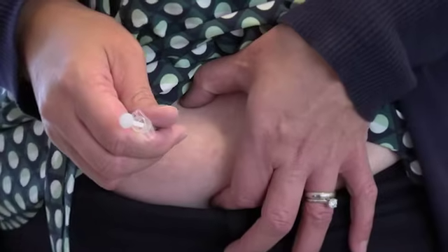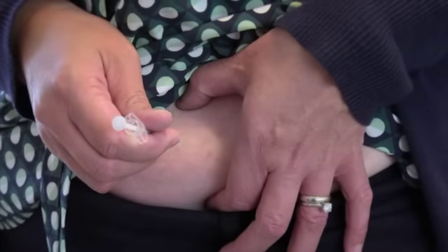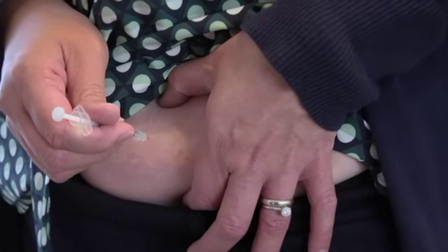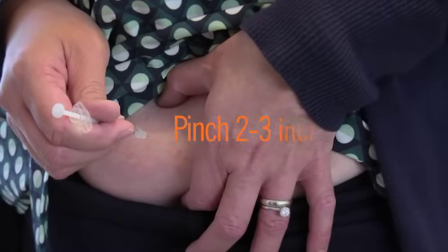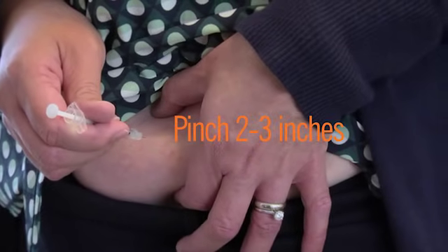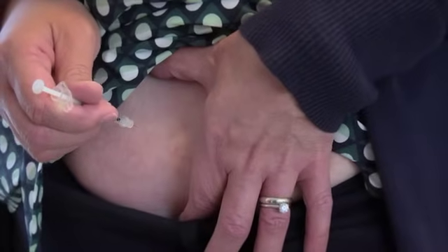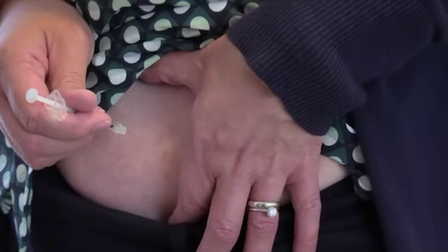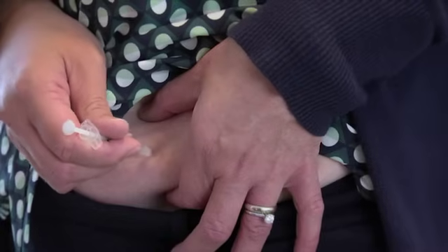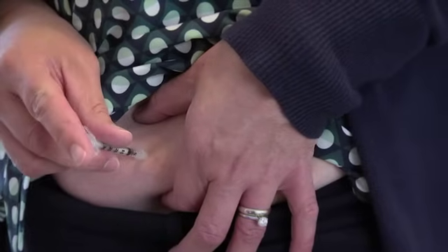Using the hand you write with, hold the syringe like a pen or pencil with the needle end down. With your other hand, pinch about two to three inches on both sides of the clean skin. Insert the needle with a quick motion into the pinched skin at a 90-degree angle. The needle should go all the way into your skin.